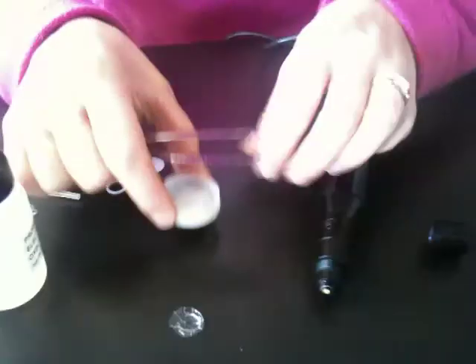So you're very simply going to pop that off. And there's the old diaphragm that has fallen off. You're going to go in here, and what you're going to find in your diaphragm replacement is a little disc. You probably had some white paper and some of the clear. So that's the actual diaphragm.